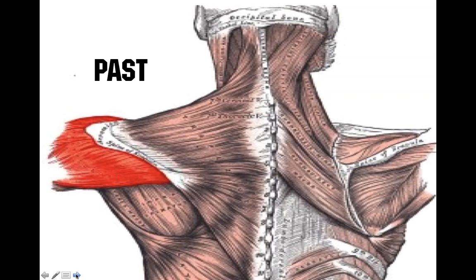Typically, what we've seen in the past is a bit more myopic view of treating an injury for an injury. I know as an athletic trainer in the early days, if you had a rotator cuff issue or some type of impingement issue, that's what you would treat. You wouldn't look above and below, the regional interdependence idea. You wouldn't look at what fascia does to the body and whether it's gliding and sliding through an assessment.